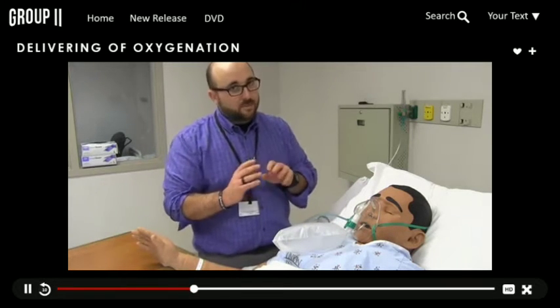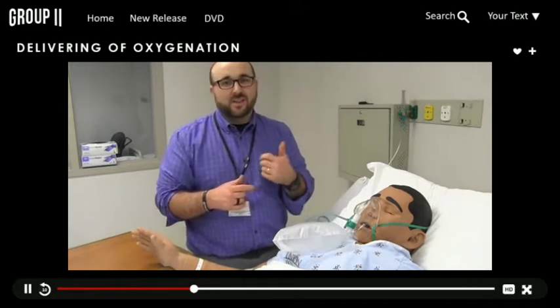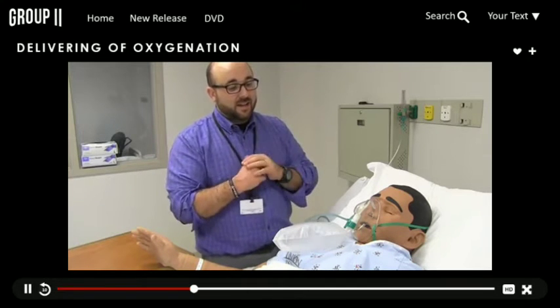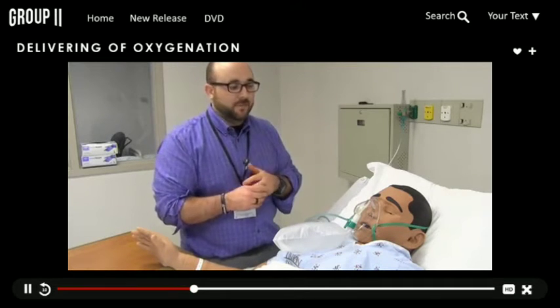Remember, a non-rebreather is temporary. You can leave them on this for a while, but they're going to need something else, either ventilatory support or non-invasive ventilatory support, because this is a high amount of FiO2 that you're delivering with a non-rebreather. So in transport it's great, but not for long periods of time.